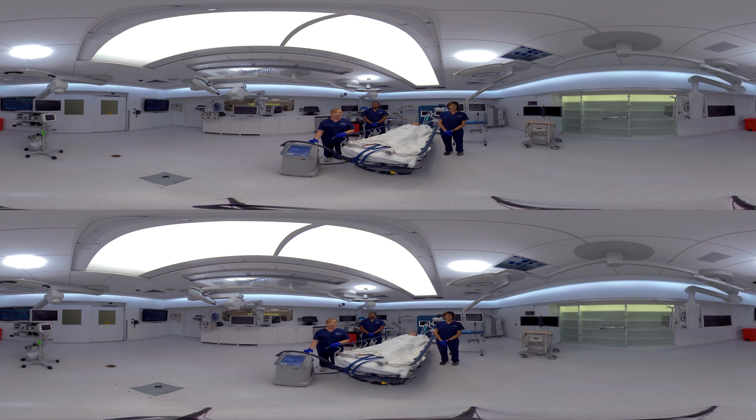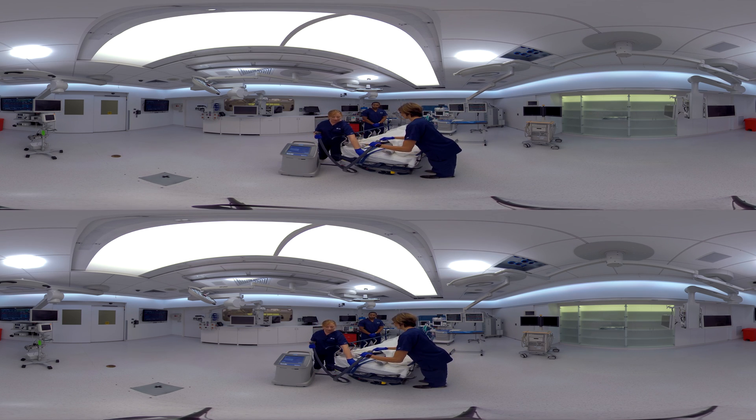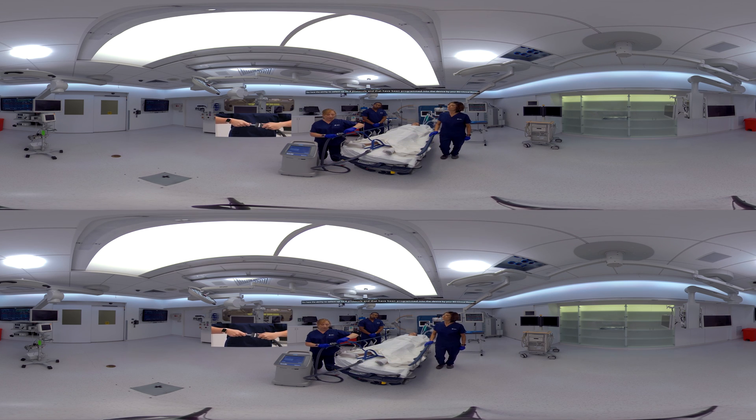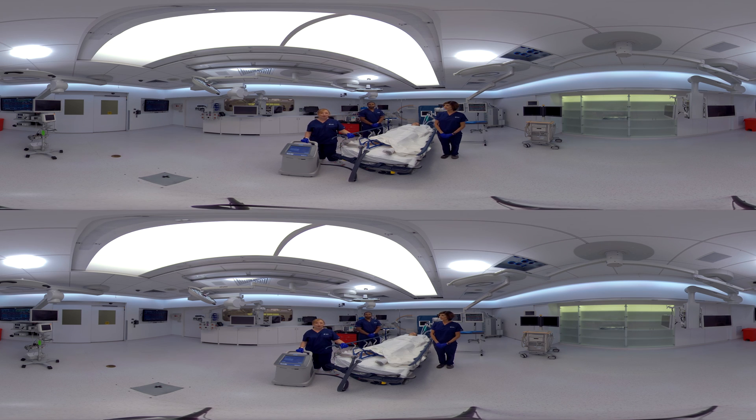We've connected a core temperature probe to the temperature cable on the back of the device. Now it's time to connect the Arctic gel pads to the fluid delivery line. In order to connect the pads, have a firm grip on the blue hose and line it up to two of the holes on the fluid delivery line. Simply push till you hear an audible click. Make sure you steer clear of squeezing the clear tabs. Now that we have everything connected, we can start therapy.